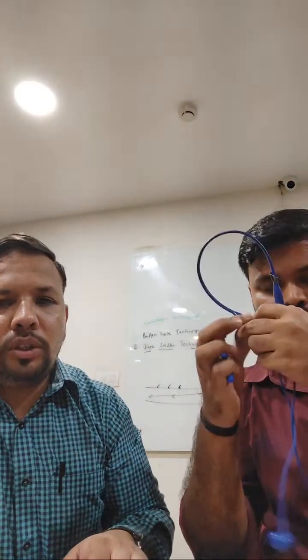Securing a needle is also a very important part of cannulation. Many times I've seen the technician put the needle in very well, but after some time, maybe due to a complication from the patient side, or maybe due to wrong positioning, the needle comes out of place. So proper taping, proper micropore, is a very important part.